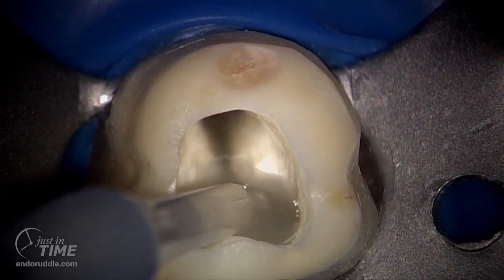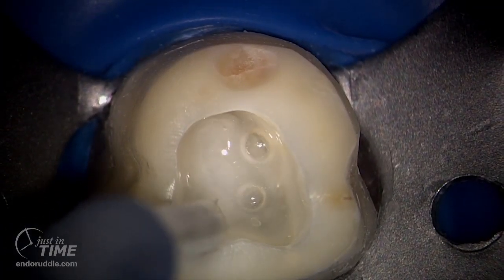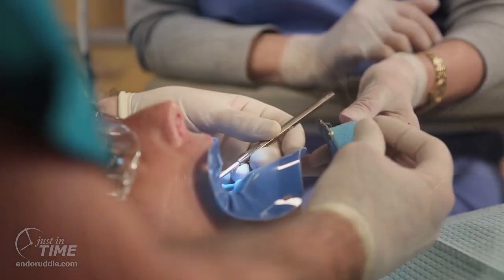Here we are, placing a viscous chelator such as ProLube, Glide, or RC Prep.